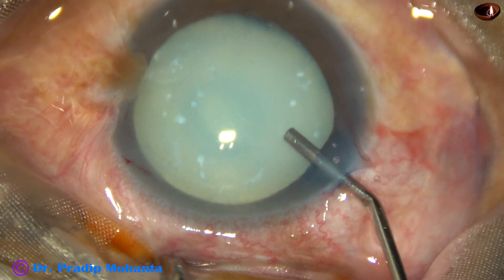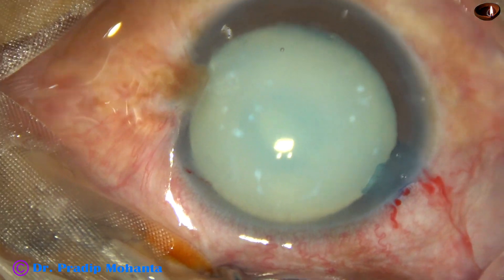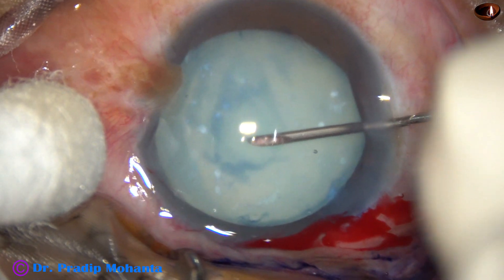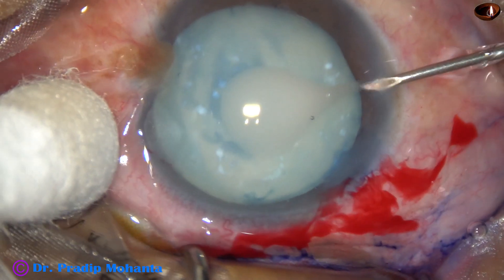This is 2% hydroxypropylmethylcellulose. Now, capsulorrhexis is to be done. The anterior capsule is incised at the center — and see what happens.